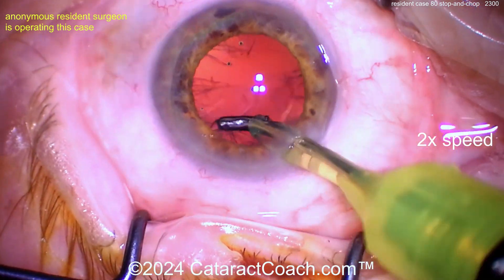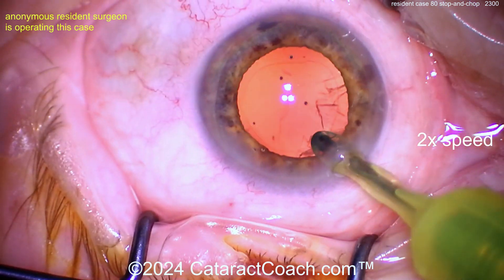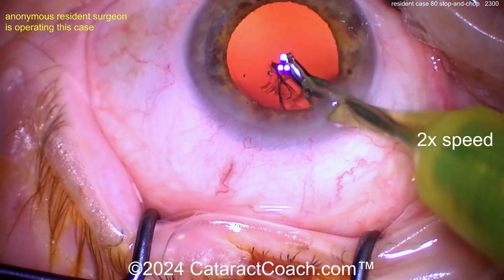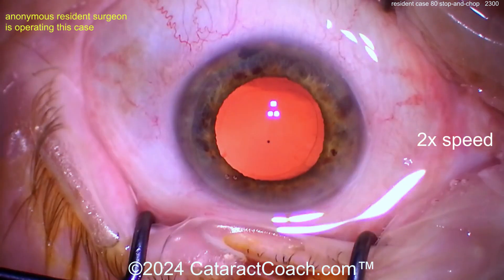Going back to the case — here's the cortex removal with the coaxial I/A probe, cleaning up pretty nicely. I like that good pivoting technique, getting that sub-incisional stuff too. Brought it out in nice big sheets — that bag looks pretty darn clean. Beautiful. Let's get the lens in.